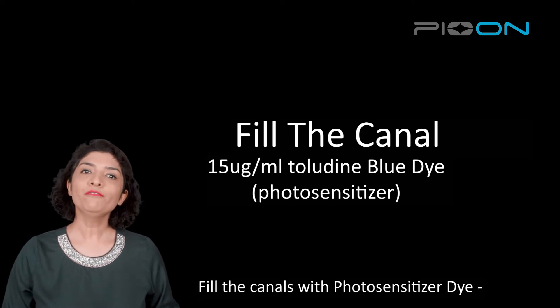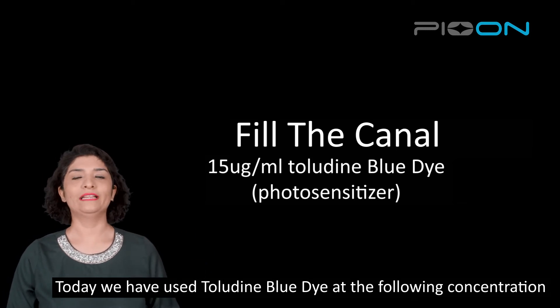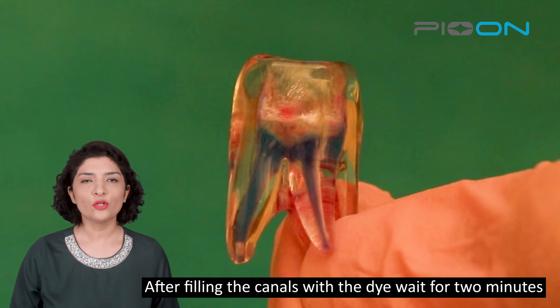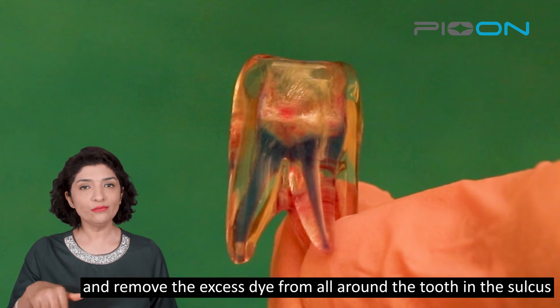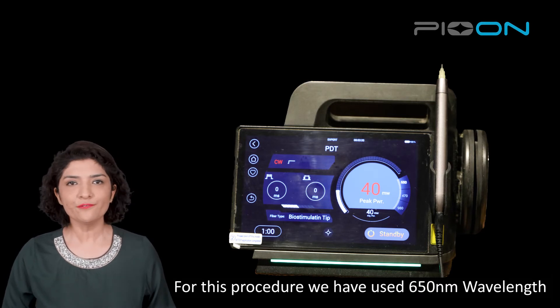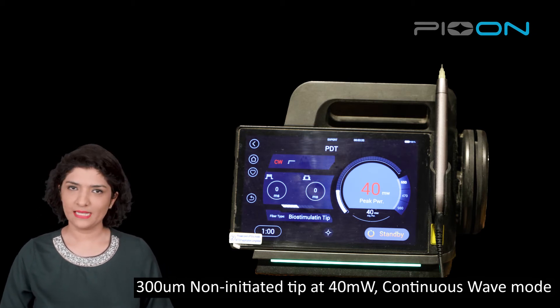After that, we will fill the canals with photosensitizer dyes. Today, we have used Toluidine blue dye at the following concentration. After filling the canals with the dye, we will wait for two minutes and remove the excess from all around the tooth and all inside the sulcus. For this procedure, we have used 650 nanometer wavelength, 300 micron non-initiated tip at the following settings.